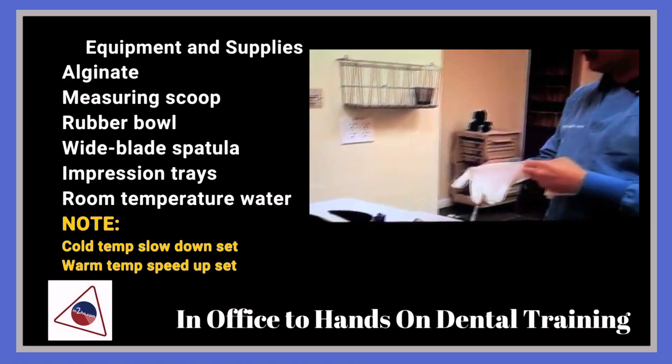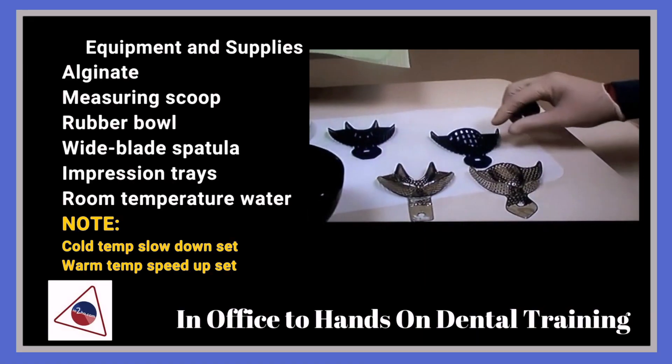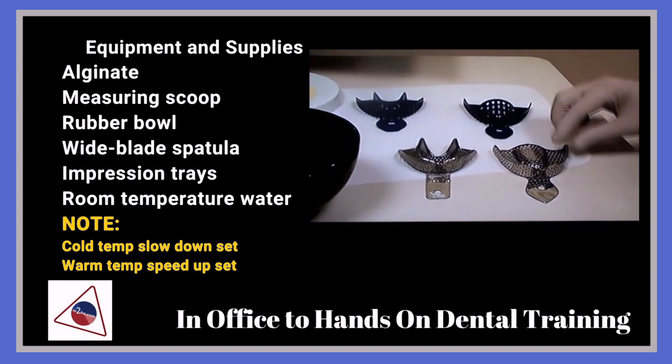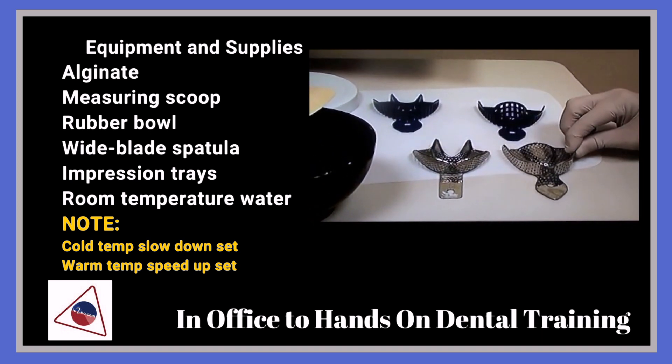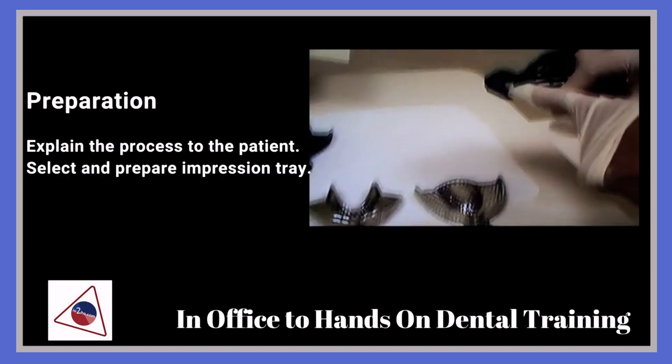There are two types of impression trays that we use — a disposable impression tray and a metal tray. The sizes of these are always on the tip.